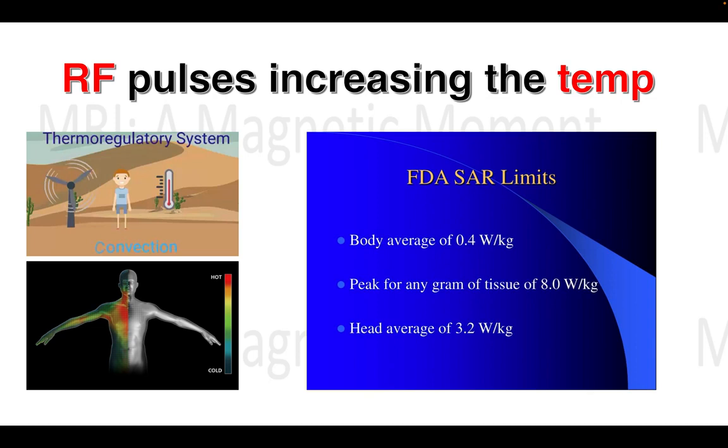Although compared to CT and X-ray, there is no ionizing radiation involved with MRI as we discussed earlier, there are risks associated with the time varying RF field. Heating and burns can occur because heating is produced on tissue near the RF transmitter and within tissues due to resistive processes within the patient.